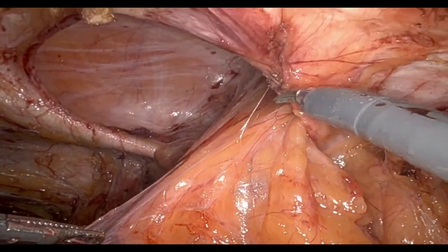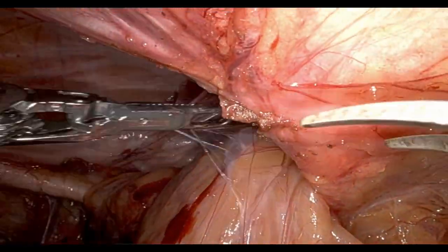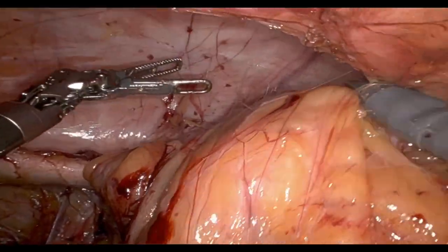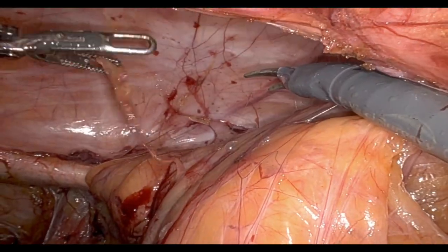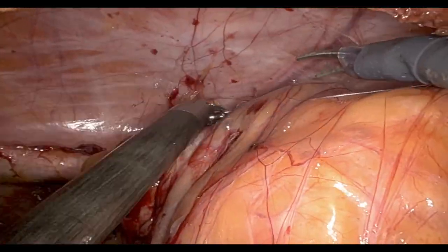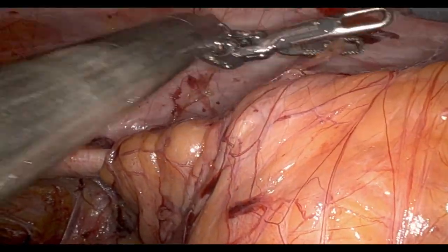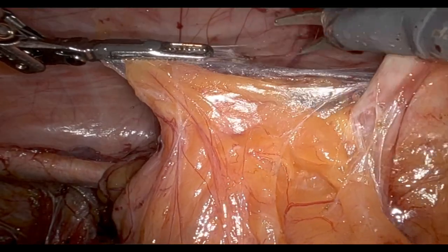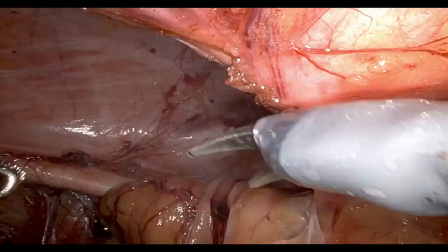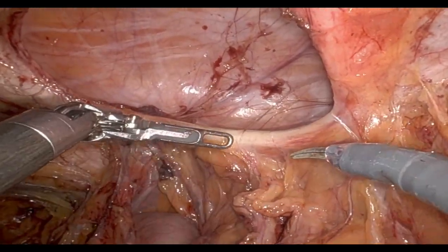This is really satisfying — a large volume of incarcerated contents here. If we had gone left-side dock first, we would not have been able to approach this, which speaks to the importance of reviewing your CT and making a preoperative plan. Also, given the morphology of this hernia, an ETEP approach would be unwise and dangerous. I really look at the morphology of hernias as a determinant for whether or not to use an ETEP approach.